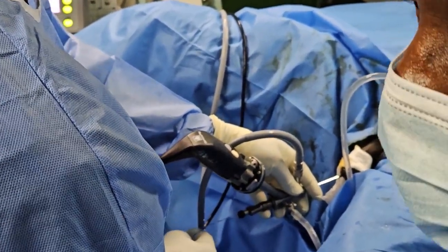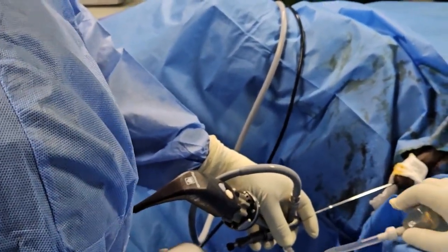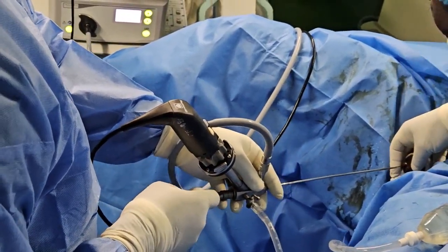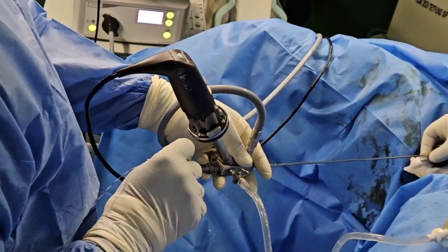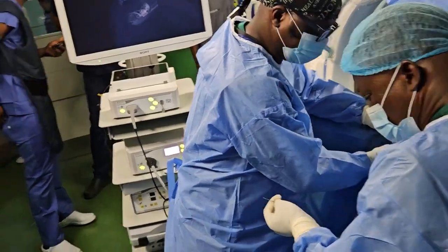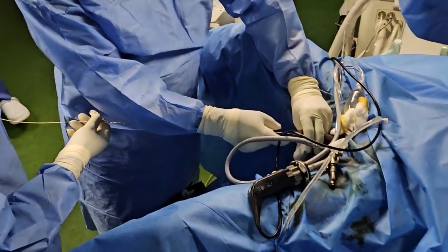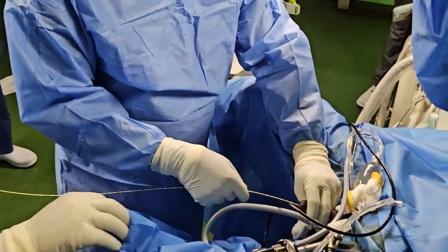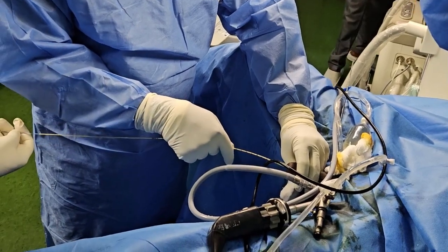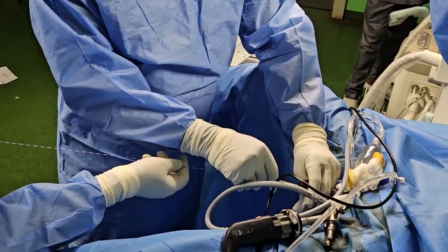So that's another thing. We started teaching in our textbooks, in our training, that semi-rigid ureteroscopy is meant for the lower ureter. By advancing up to the PUJ, you really get more experience, and at the same time, the anatomy of the ureter will determine how far you can go. This is key. Straightness, yes. It's always straight, yes.